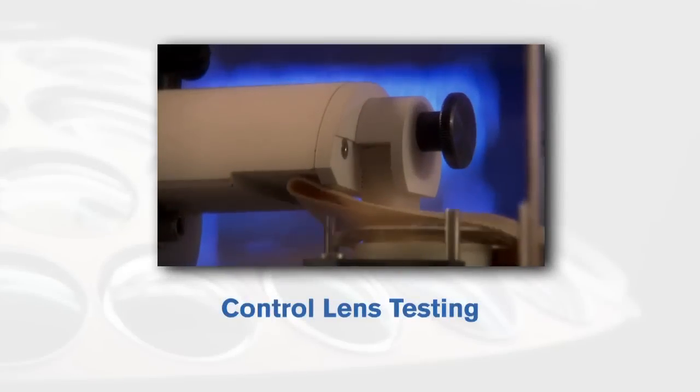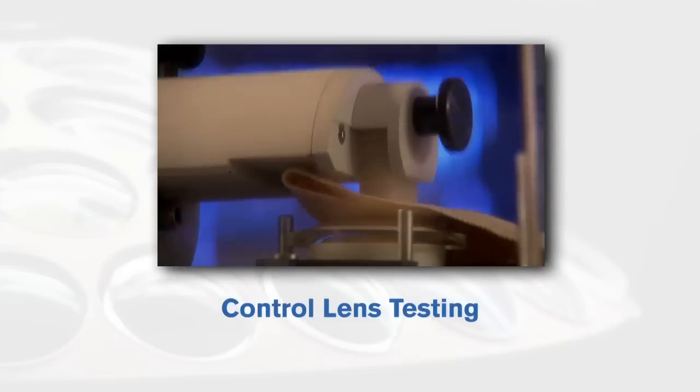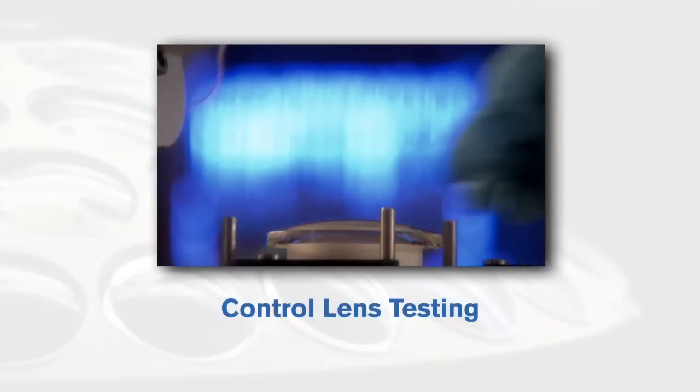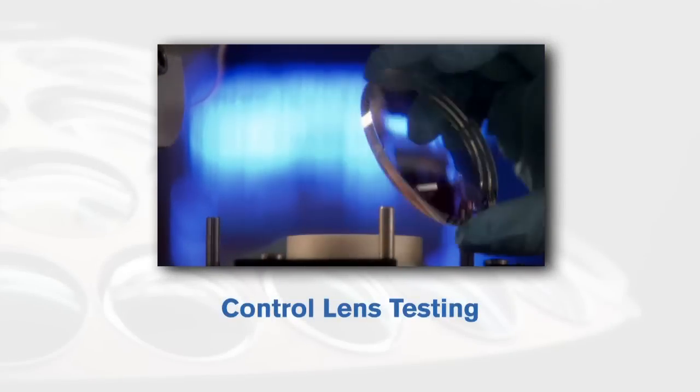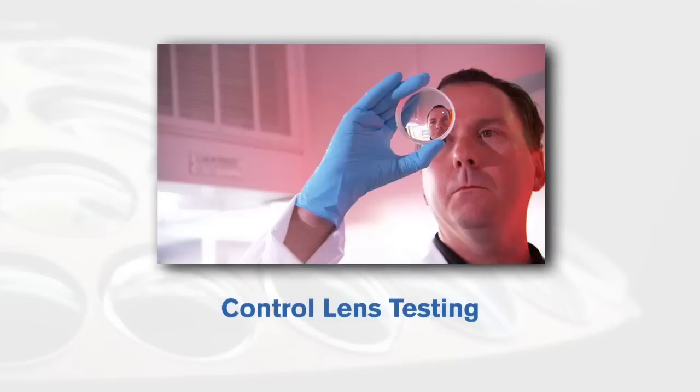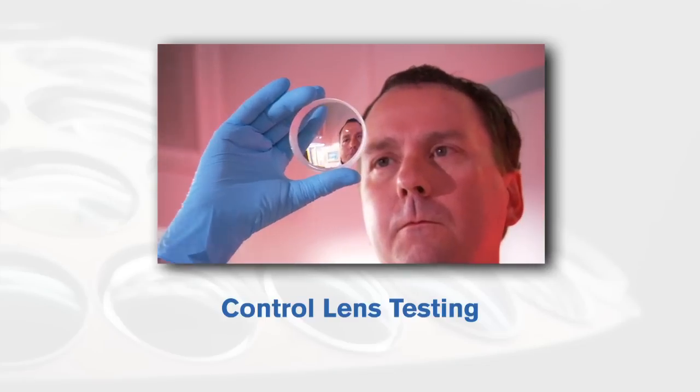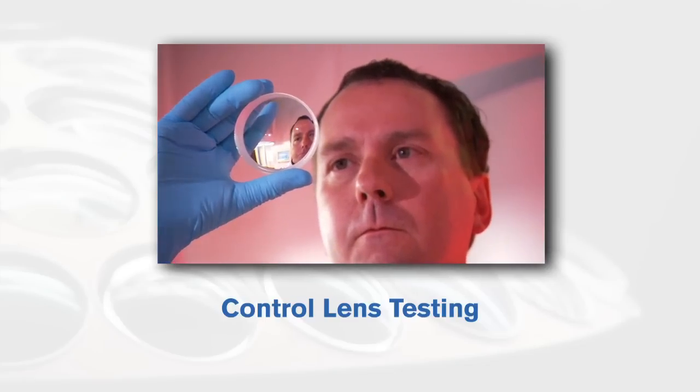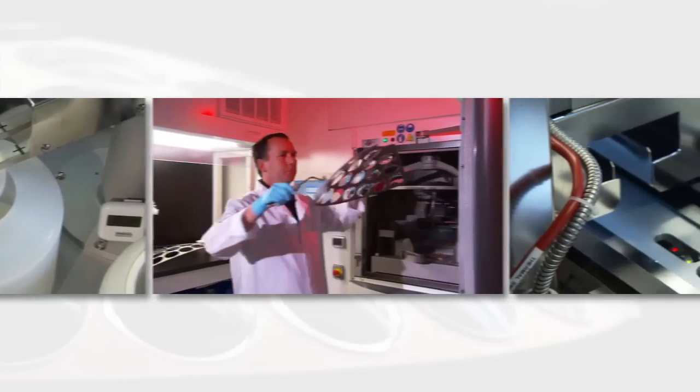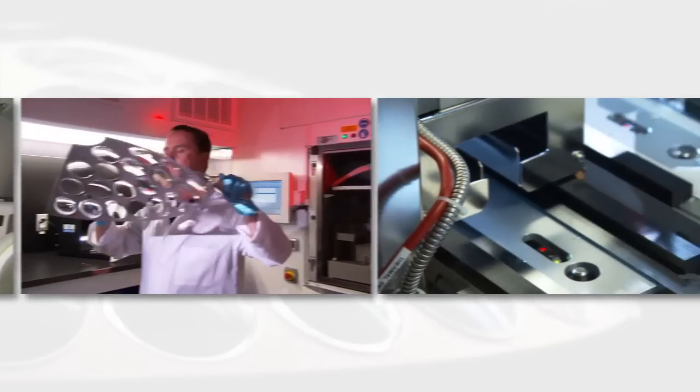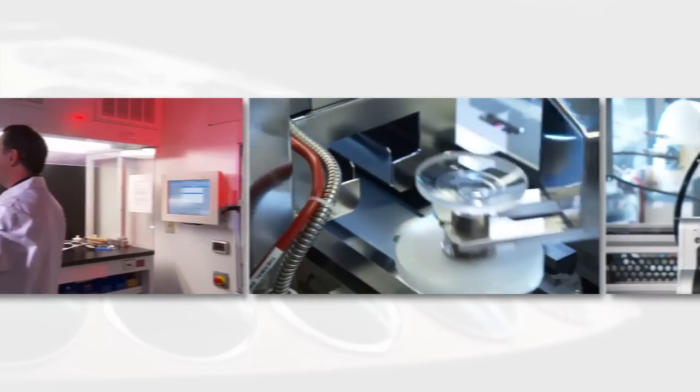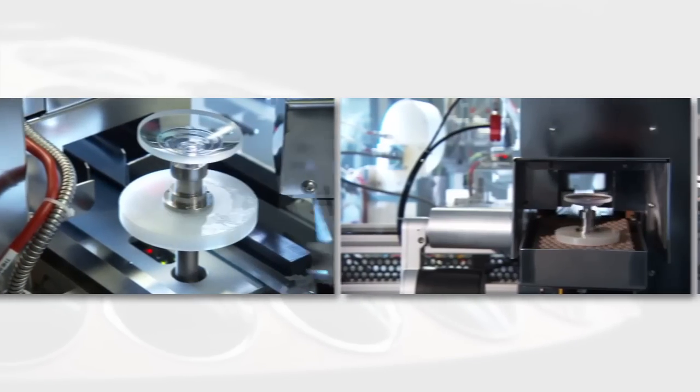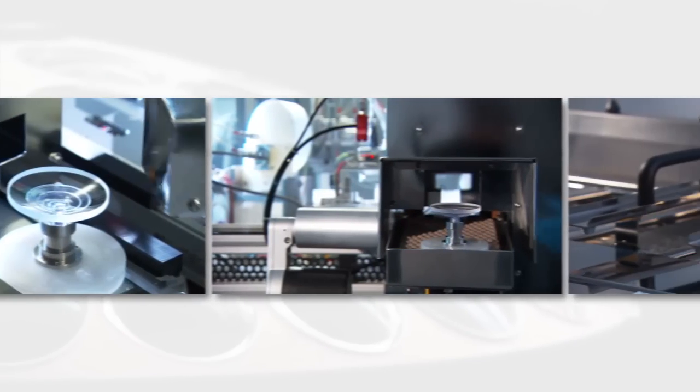With the hard coating and AR treatments applied, a control lens from every Crizal batch is tested for quality. As you can see, the application of the Crizal anti-reflective technology is a very sophisticated and technical process.